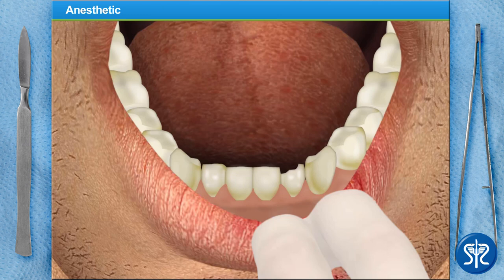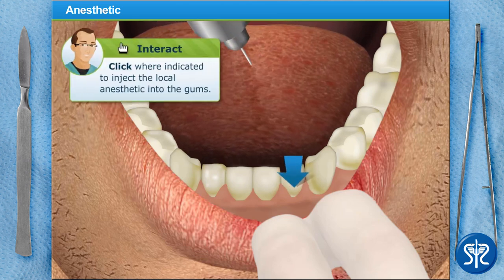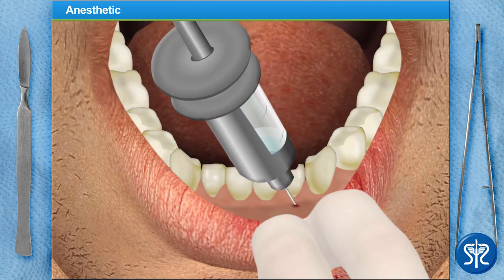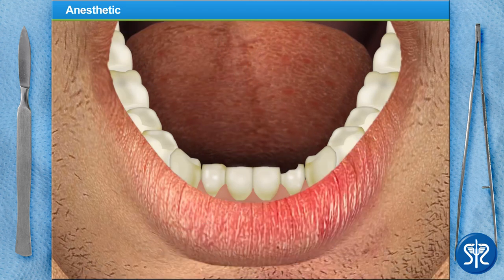After the anesthetic has taken effect, the area around the tooth and the patient's lower lip should be numb for a few hours. Inject the local anesthetic into the patient's gums just below the tooth we'll be working on. Let's wait a few minutes to allow the anesthetic to set in.